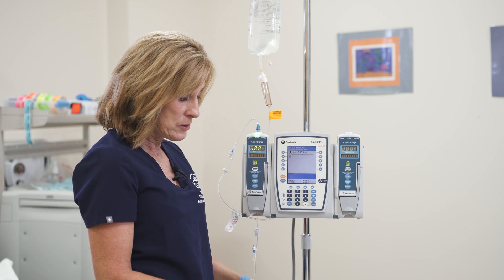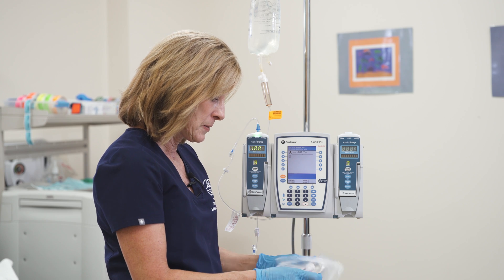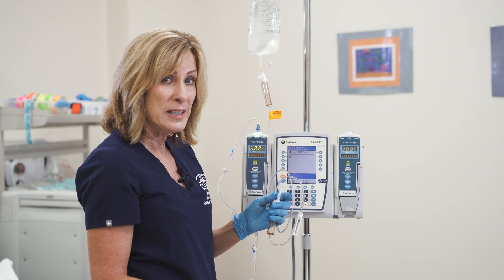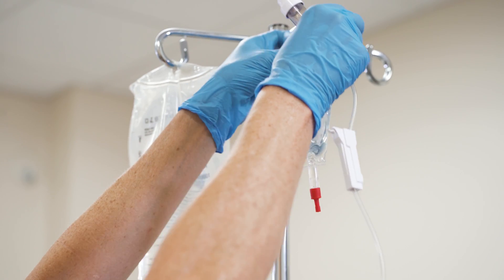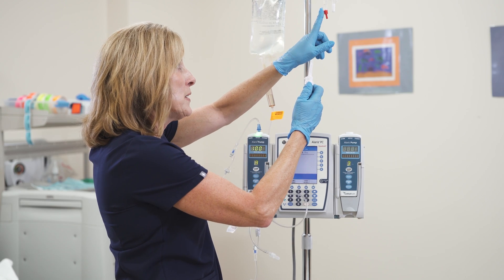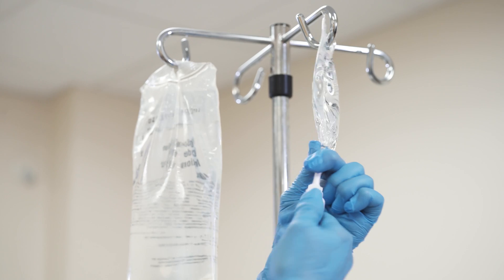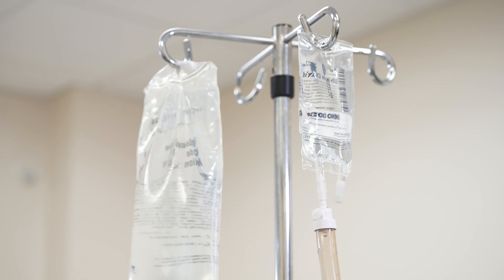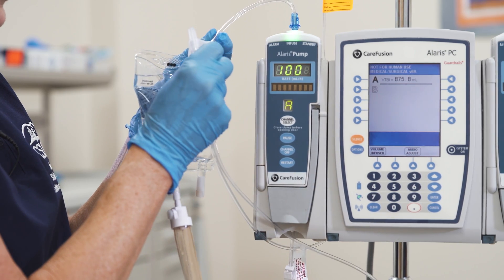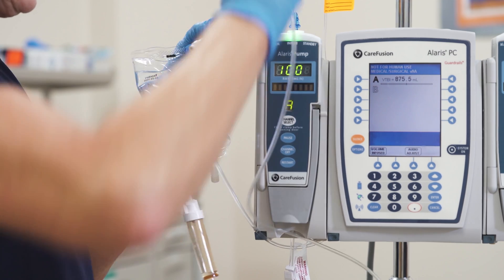I'm going to go ahead and back prime this. I've got my secondary tubing fresh off the cart. I'm going to open it up, take it out, and you'll notice the clamp is open — always close that clamp. Now I'm going to hang my Cefazolin and prime the tubing, maintaining sterility of both ports. I'm going to select the port to connect the secondary tubing, making sure it's a port above the pump. I'll cleanse it with a brand new alcohol prep pad for 15 seconds or whatever your facility policy dictates, then connect the tubing to the port.